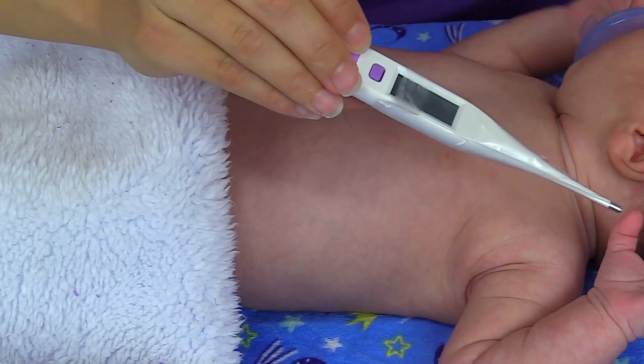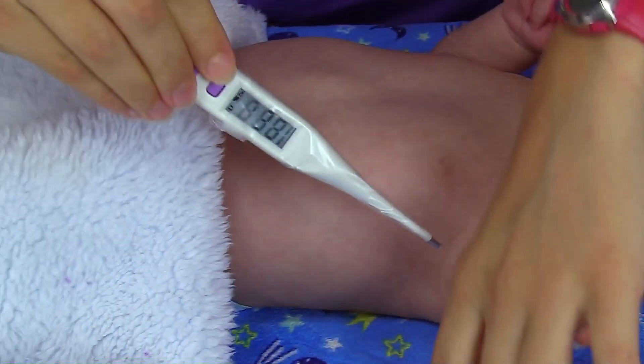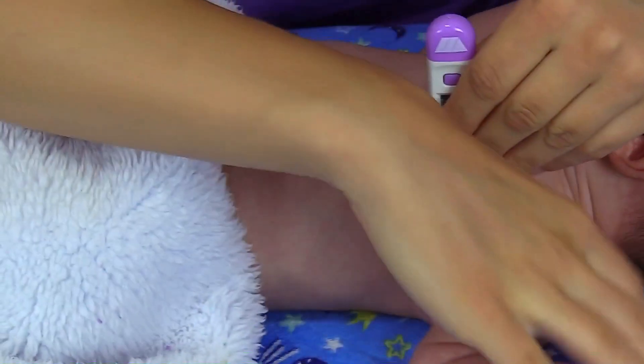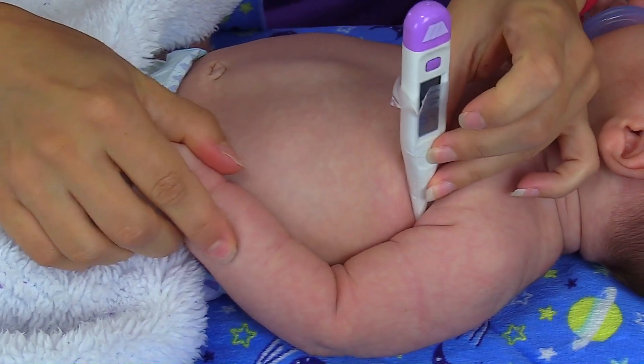To take the temperature, make sure that you turn the thermometer on, and then you're going to place the tip of the thermometer deep inside the fold of the armpit. Then you're going to put the arm down and wait for the thermometer to beep to tell you the reading.